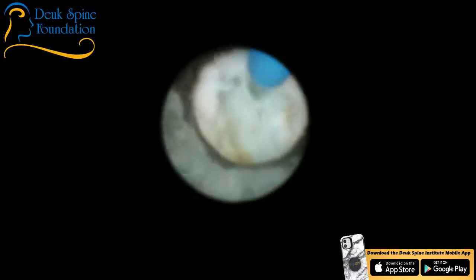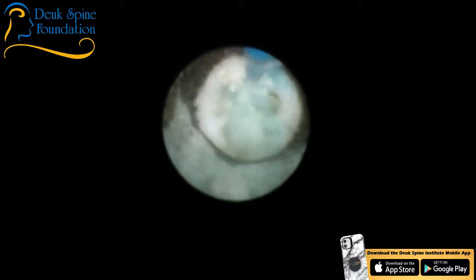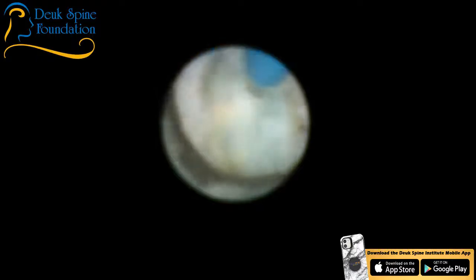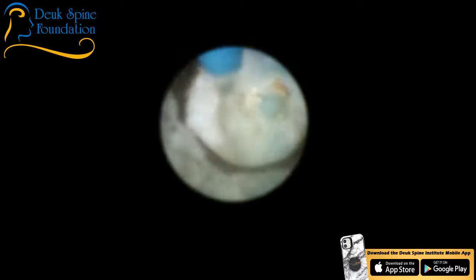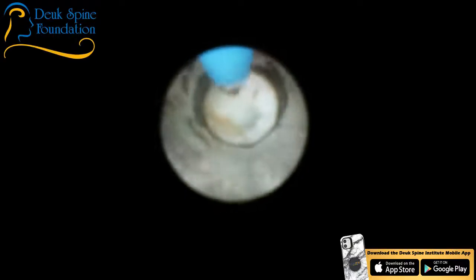So the idea here with the laser surgery you're watching is to just get rid of the herniation and the annular tear, clean them out. Then you don't have to take the whole disc out. You don't have to do a fusion. But you can see how badly damaged this disc is.